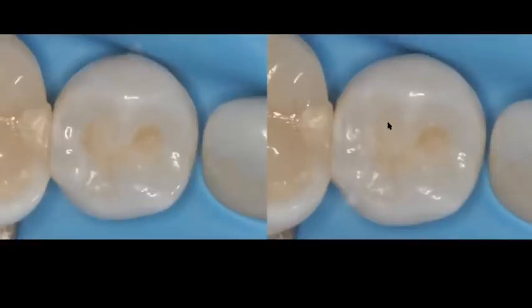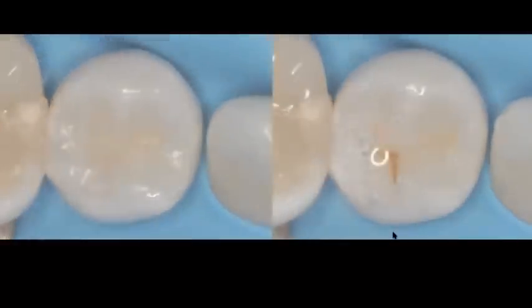So I'm going to just go in and start adding my composite little by little, in very small increments. But I'm just trying to be very careful and very selective of the way that I do these layers so that I can end up having something that looks like a tooth. I'm going to now have a little pit here. I'm going to stain that pit. What you're seeing here is glycerin.